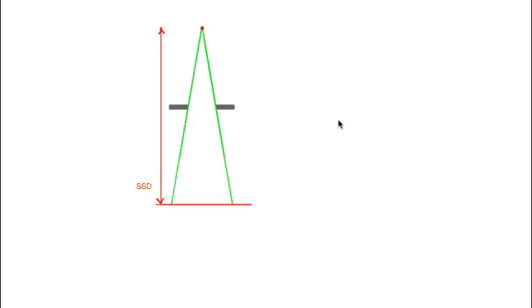So the key to this is, instead of fixing this constant SSD in the setup like we've been looking at so far, we're instead going to fix this point here. That's the isocenter, the point where the gantry rotates around. That's typically how we do treatments. And then we can change the distance, the SSD, in this setup. It can be at different levels, but we're going to keep the isocenter to be the same point right here. So that reflects the practice of how treatments are done.